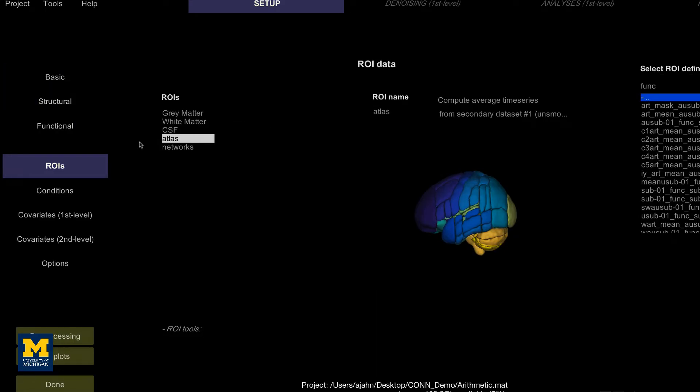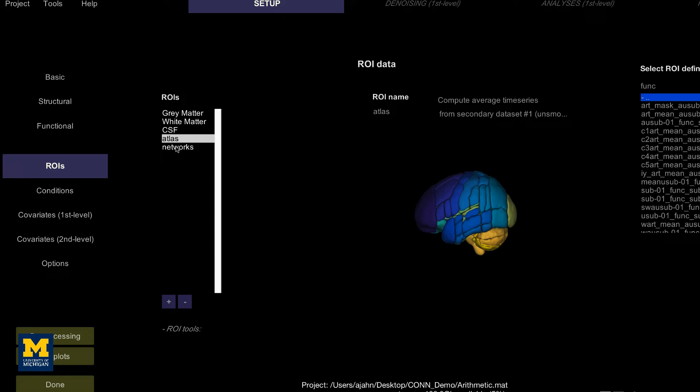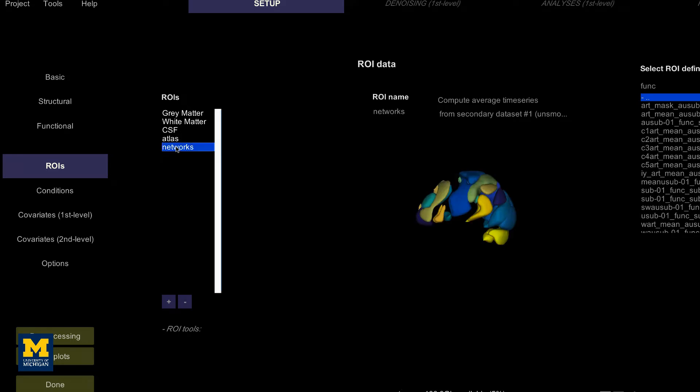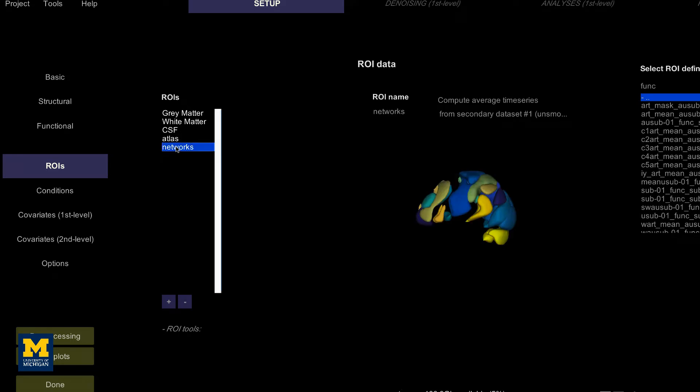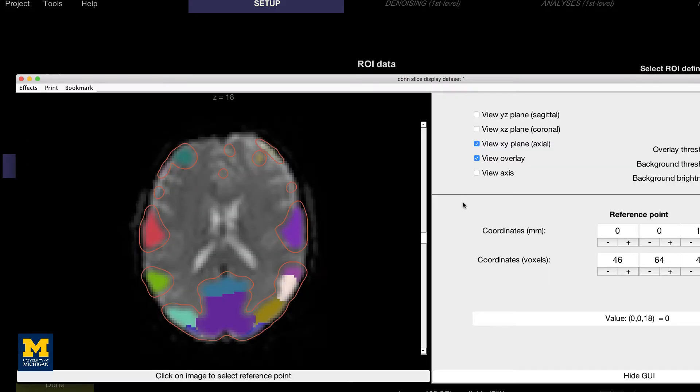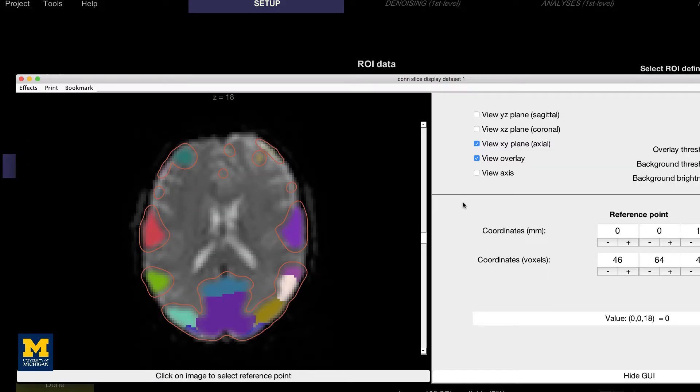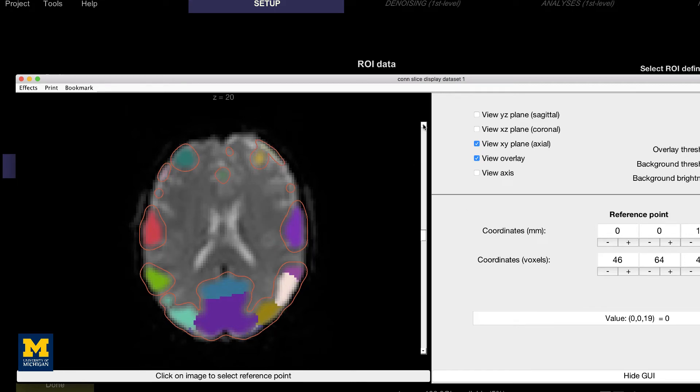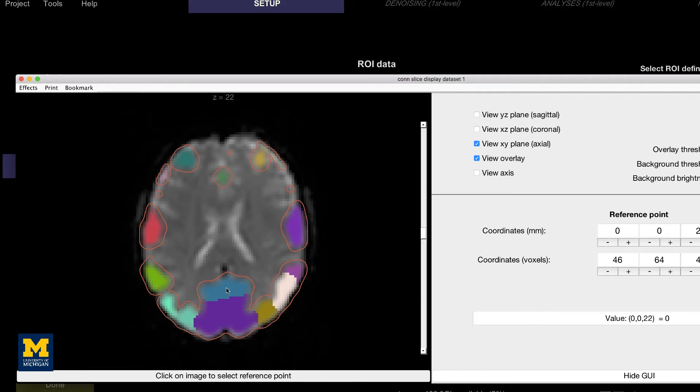The same idea is illustrated in the networks tab, which assigns groups of nodes to a single network. The default mode network, for example, is a combination of a node in the posterior cingulate cortex and a node in the ventromedial prefrontal cortex. As with the cortical ROIs, you can open up a new viewer by clicking anywhere on any of the slices.